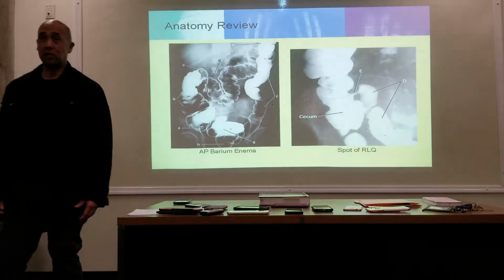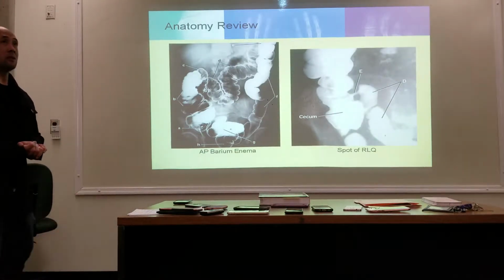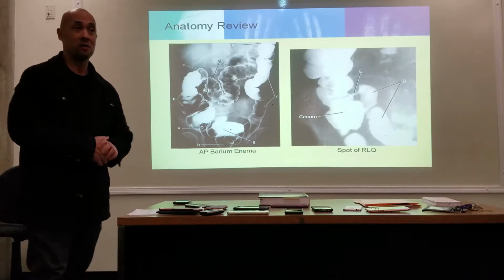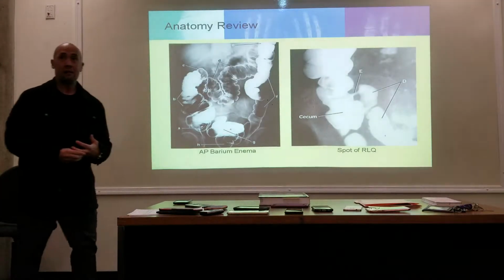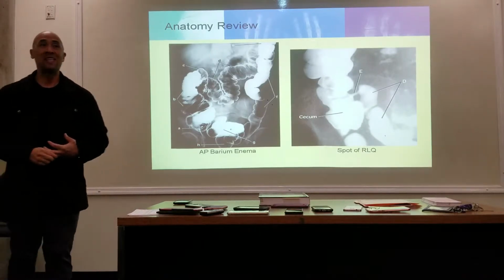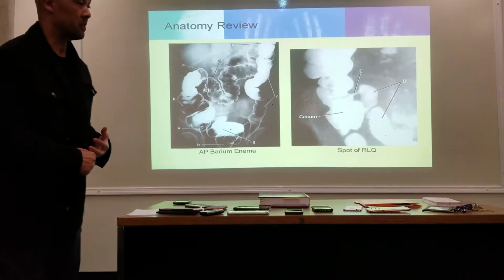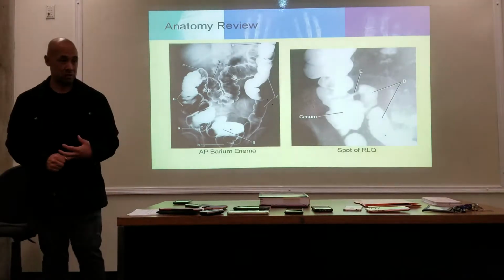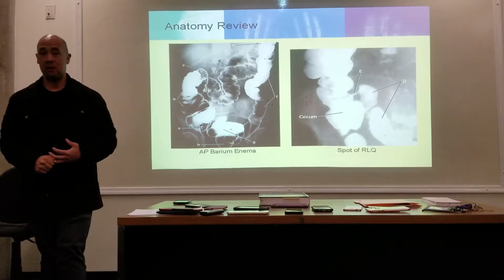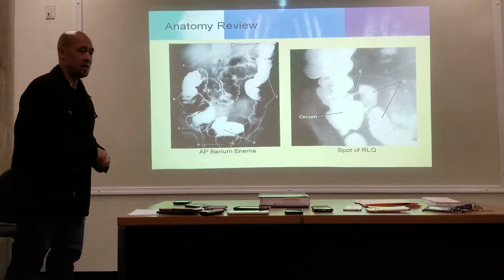I had a procedure, a long time ago, over 20 years ago, where we did a gastrografin enema. We didn't use barium because there were indications that this patient may have had a bowel obstruction. So we filled up the bowel with the gastrografin.